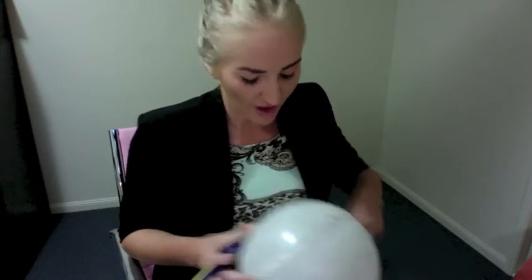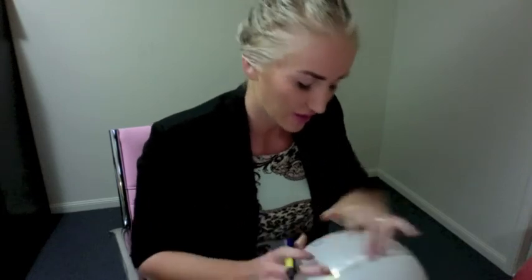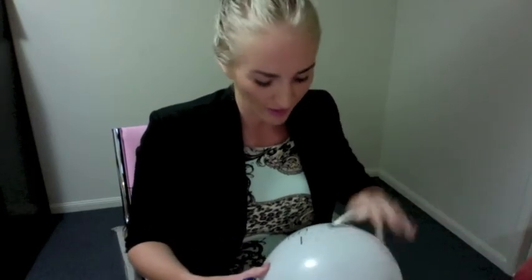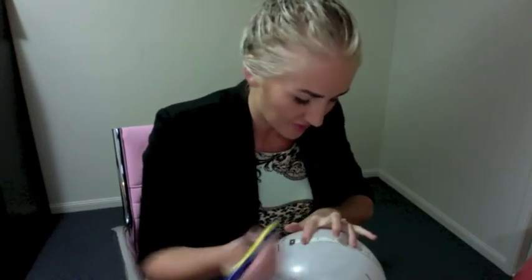So we get 35, so we'll do 10% again, so 10%, 3.5, again on the other side, 3.5, and we go up 20% again. So that will be 7 centimetres above those points, so 7. Now that we have T3 and T4 marked, we can determine the horizontal plane.